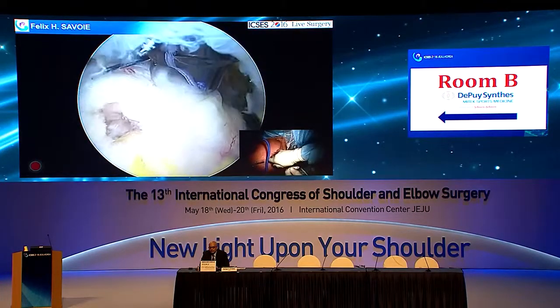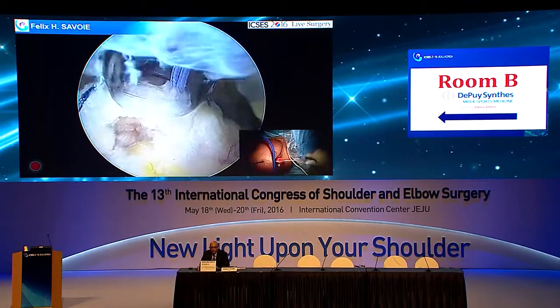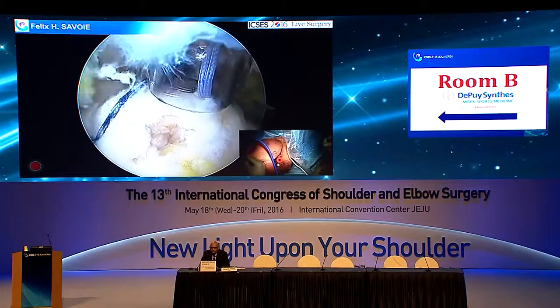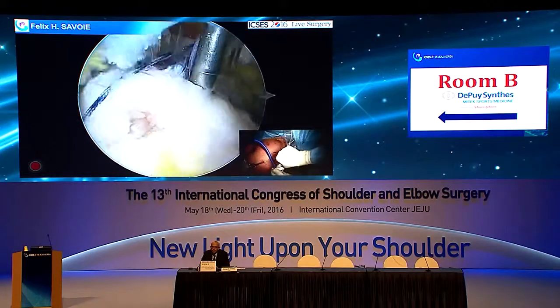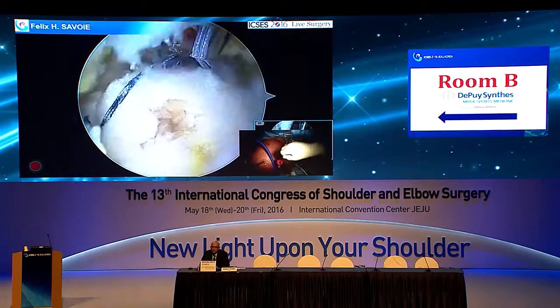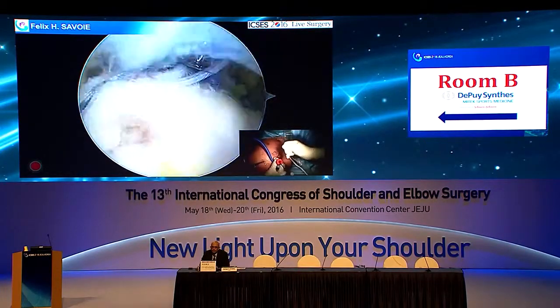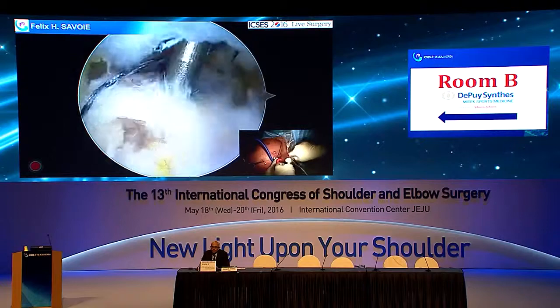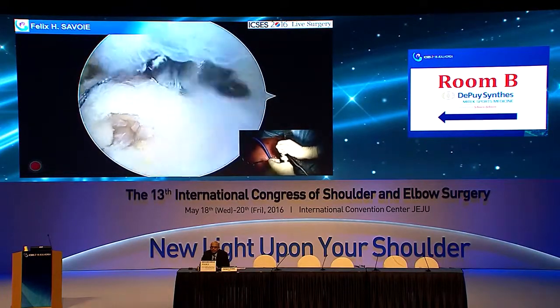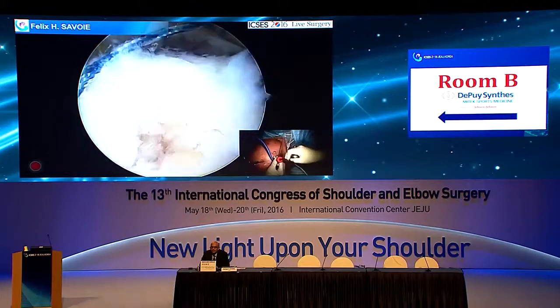So now we have this all closed, see? And so we have 3 mattress stitches. So essentially that's a single row. It's all closed. Doesn't look bad. And so the question is, this lateral part is what we want to make sure we take down. So we could keep one if we wanted. I'll tell you what I'll do is I'll keep one. I'll show you something. All right, so let's leave one there.